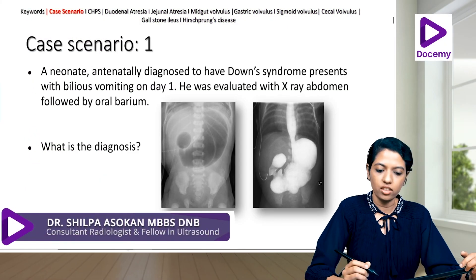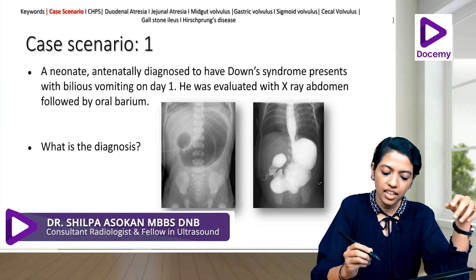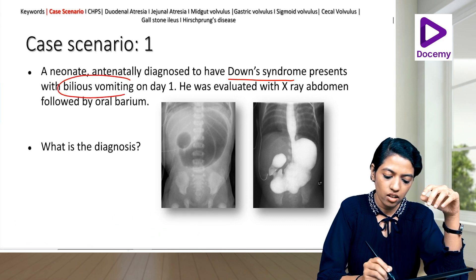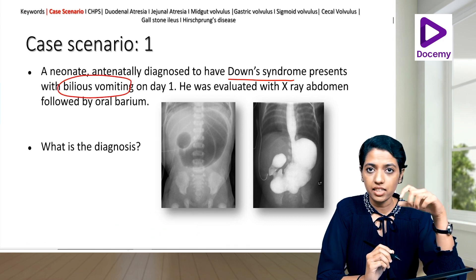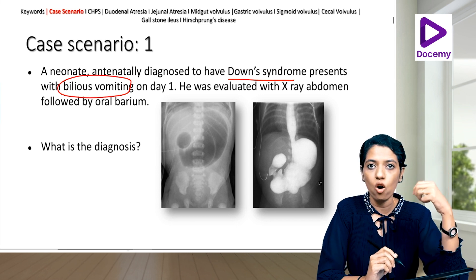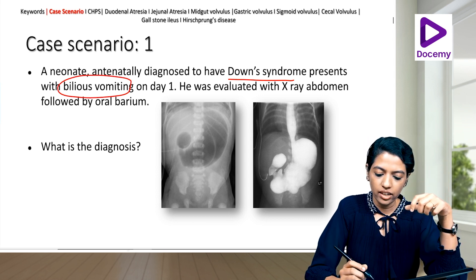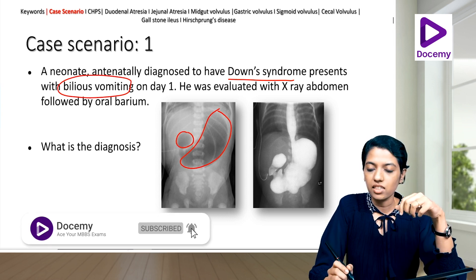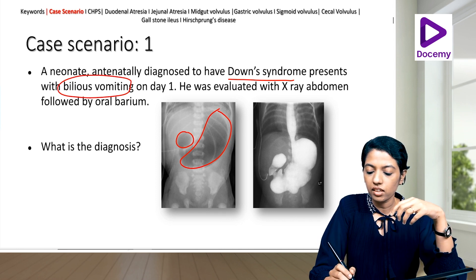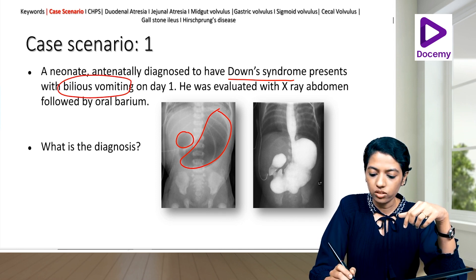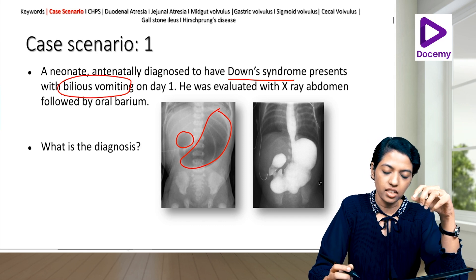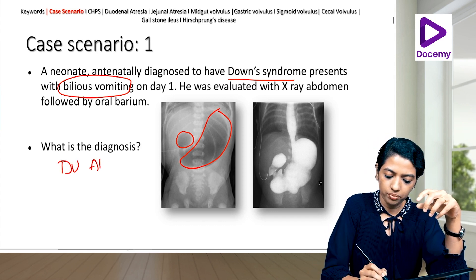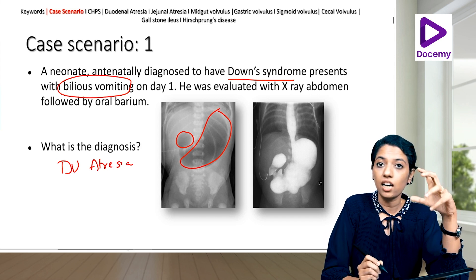Coming to the case scenario: a neonate antenatally diagnosed to have Down syndrome presents with bilious vomiting on day one. He was evaluated with x-ray abdomen followed by oral barium. On x-ray you get the double bubble sign, and it is confirmed on barium — barium does not pass distal to this point. So what is your diagnosis?